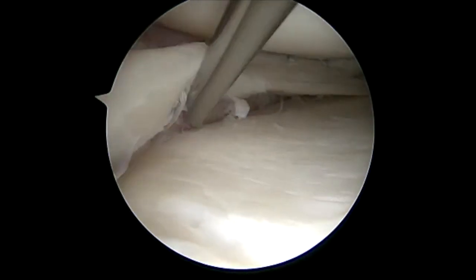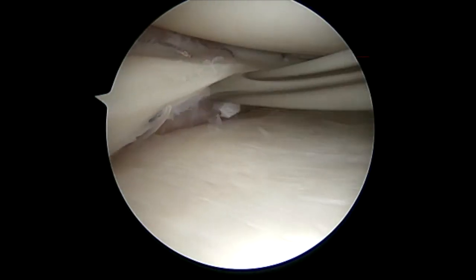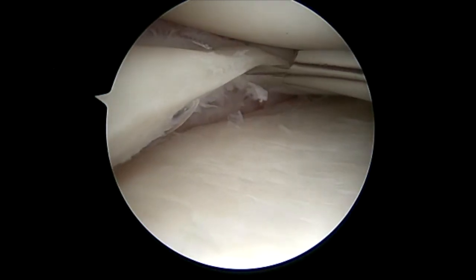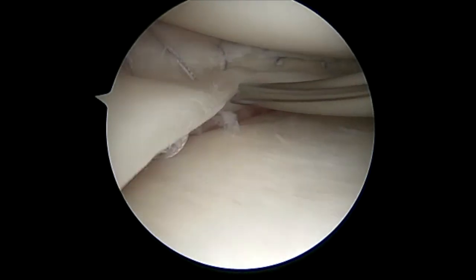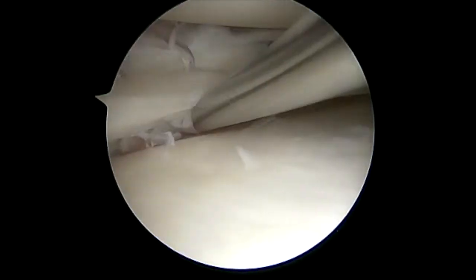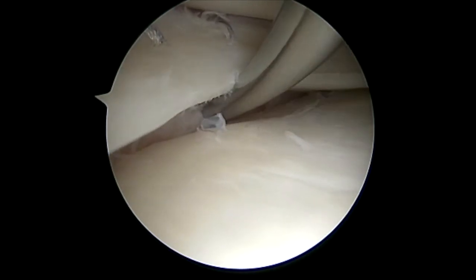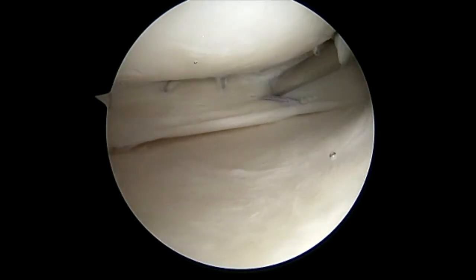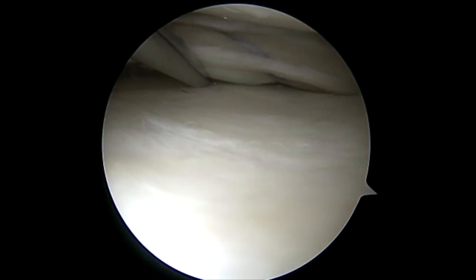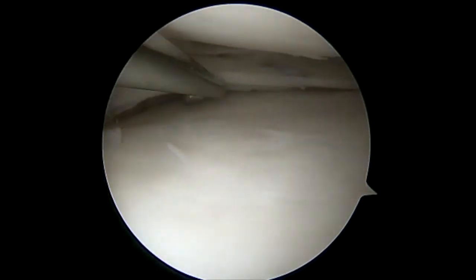As you can see, the meniscus is now sitting flat. We place one more stitch in an area where we think it may add further improvement to fixation, using a small portion of the needle to hold it and then entering through the meniscus into the capsule. Once these are completed, we remove all the needle ends. We have now tied all the sutures to the capsule at 90 degrees and use a probe to demonstrate excellent reduction of the meniscus.